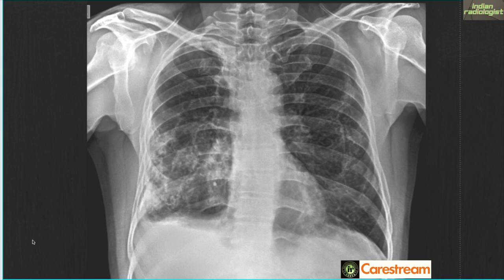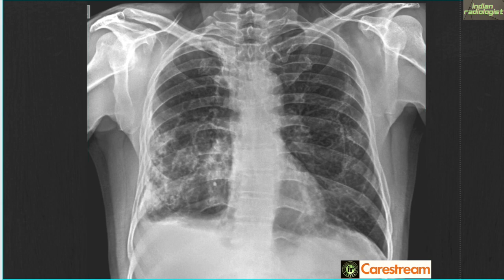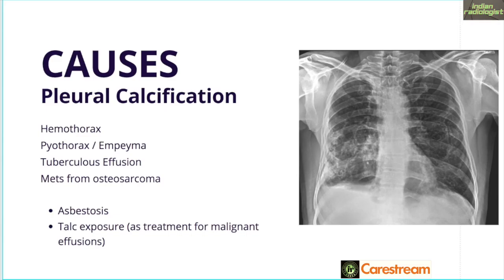What we see is dense calcific areas seen at the right costophrenic angle. The costophrenic angle is blunted and you can see calcification extending upwards. There is also a little streak of calcification on the left side. This is pleural calcification. Causes of pleural calcification are usually hemothorax, pyothorax, empyema, as well as tuberculous effusions. Rarely, metastases from osteosarcoma can also give rise to pleural calcification.